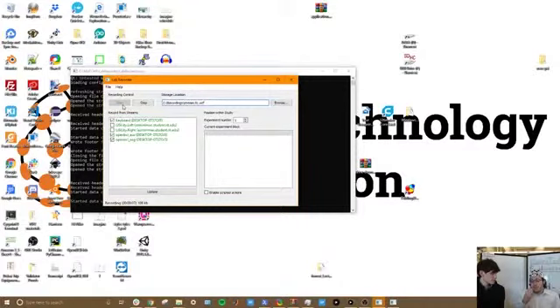Yes. My eyes are open. Yes, your eyes are closed right now, right? So you press O to open. Oh, okay. Ready? C to close.